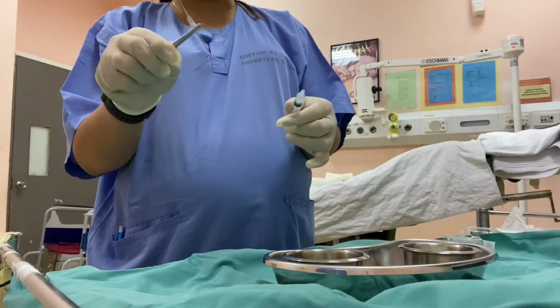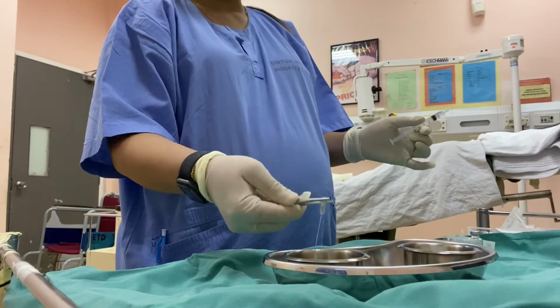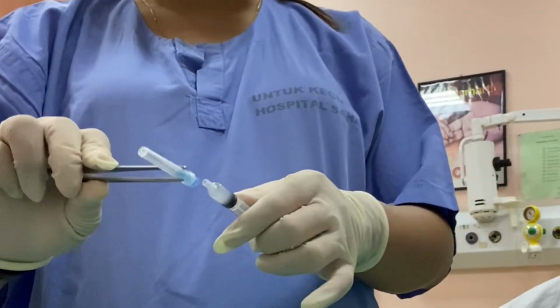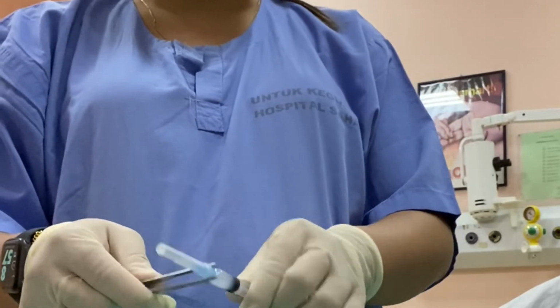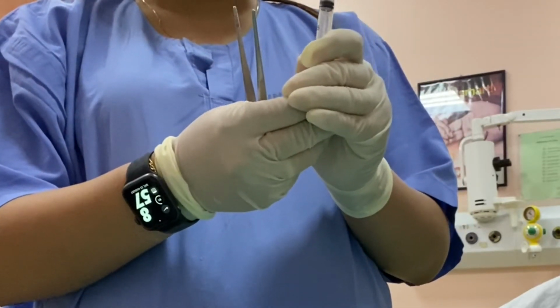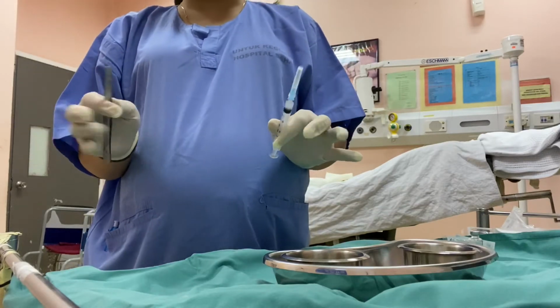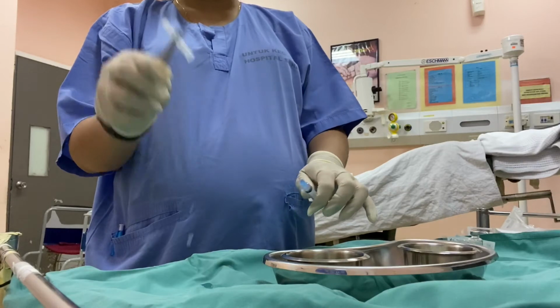And then this needle can be thrown into the sharp bin. Then take the smaller needle and place it on the syringe, and then this needle can be used for the patient. If you want to serve the patient, you just open the cap of the needle using the forceps.